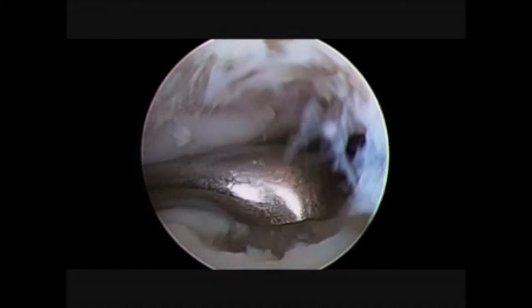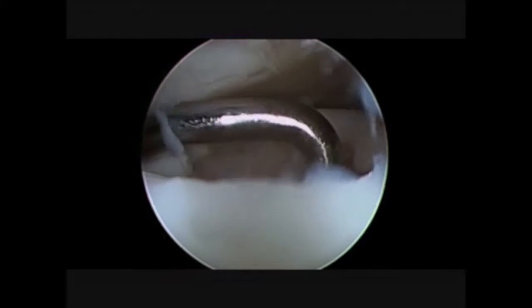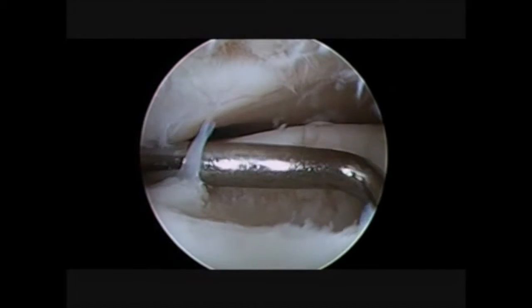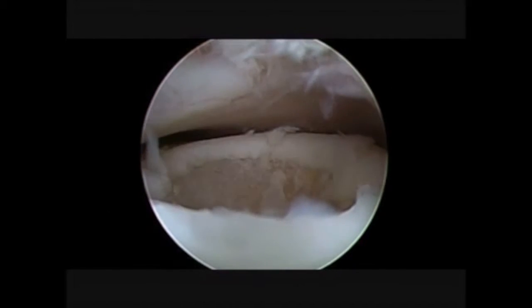We see the chondral lesion and we see the chondral bone exposed. It is mandatory to verify the stability of the lesion and to obtain shoulders around the lesion that are really stable and fixed. So now we are checking and looking for this stability.